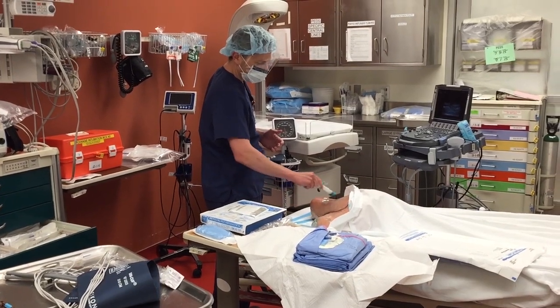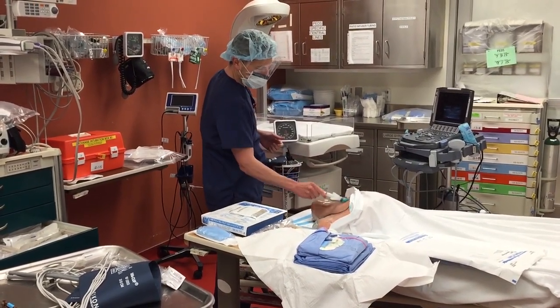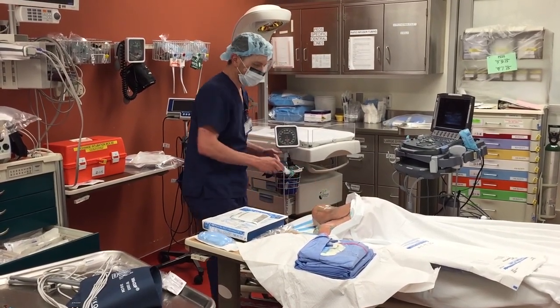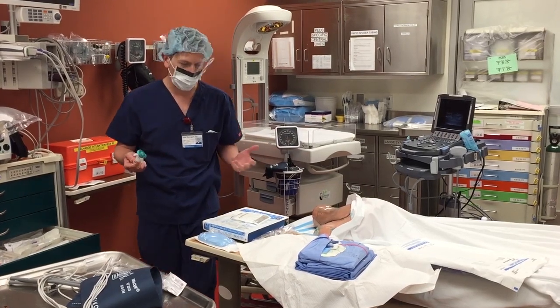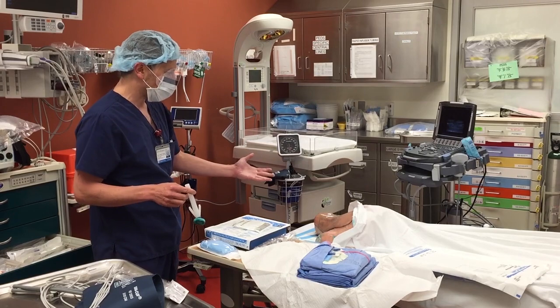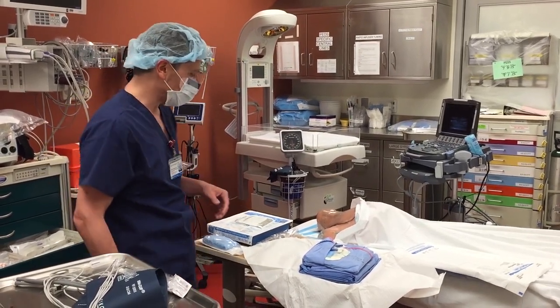We prep all the way down to the bed on the neck and towards the contralateral side. Basically, the more prepping you do the better — this stuff's cheap, but central line infections are expensive. That whole thing about circular prepping — that's all crap, you don't have to worry about that. But you do need to allow this to dry, because they don't actually get the spot sterile when wet.